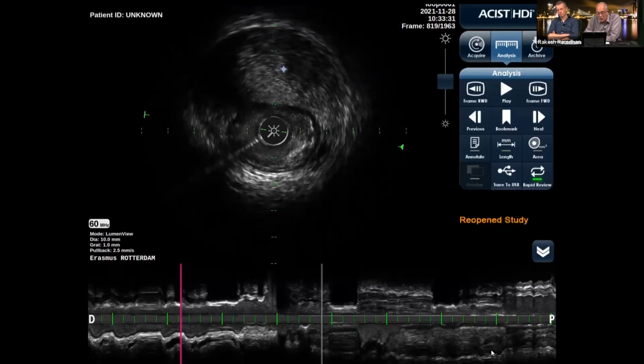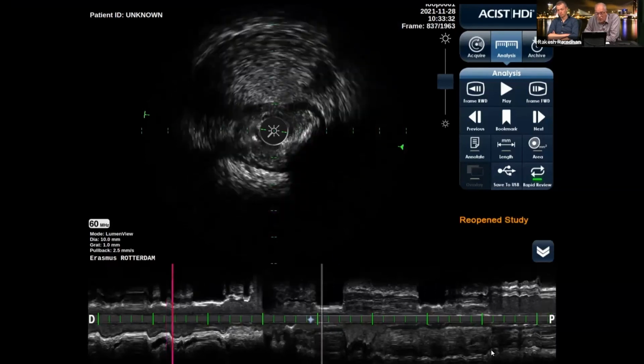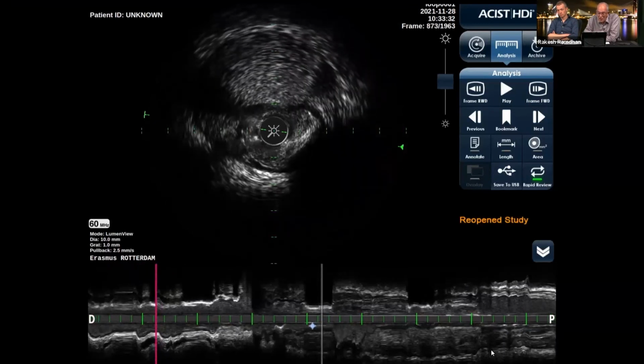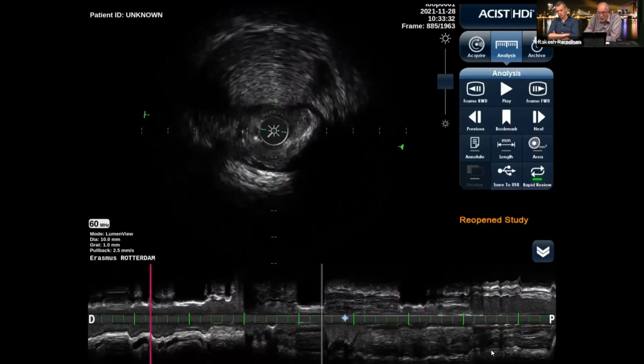that you have this compressing hematoma in there. So if we continue there, then yeah, it looks like a spontaneous dissection. That is what we also wrote in our report with a question mark, because often with this age, what was the age of the patient? 50. 50, a male patient with a plaque, it would be very unlikely or rare that you will find a spontaneous dissection in there. But nevertheless, it's possible and we have to deal with it.